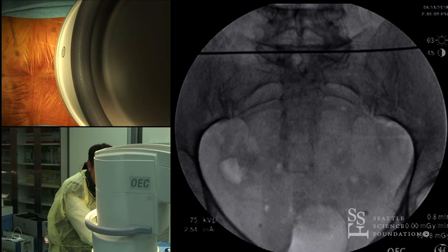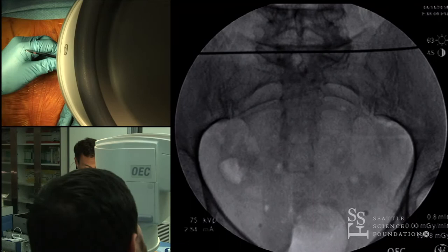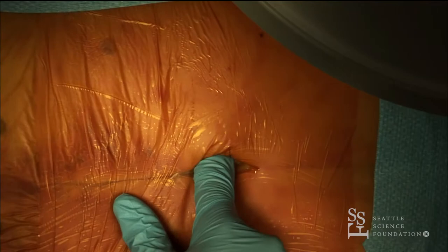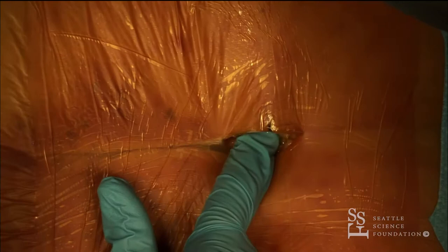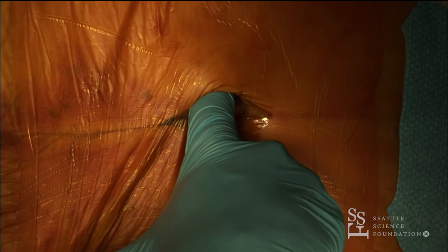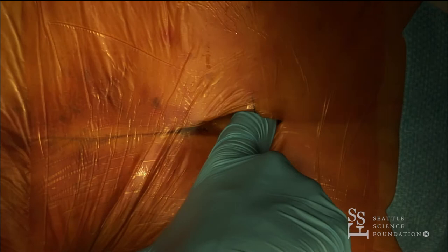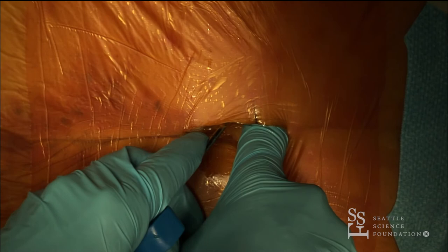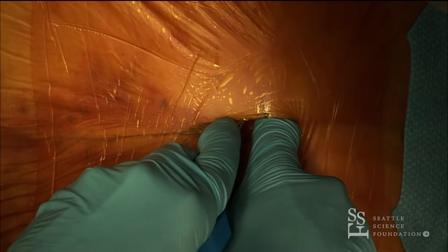The incision can be no more than one inch — you make a small midline incision, but the incision is only through the skin. Then you find your way laterally, feeling the spinous process of the sacrum and moving lateral. You want to feel the posterior foramina of the sacrum, and the S2 alar entry point is almost what you use as your landmark. Then you place your Jamshidi needle right there.